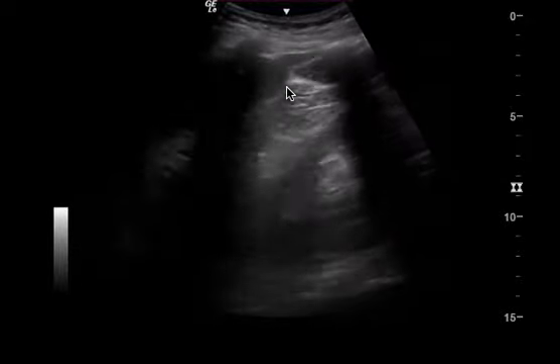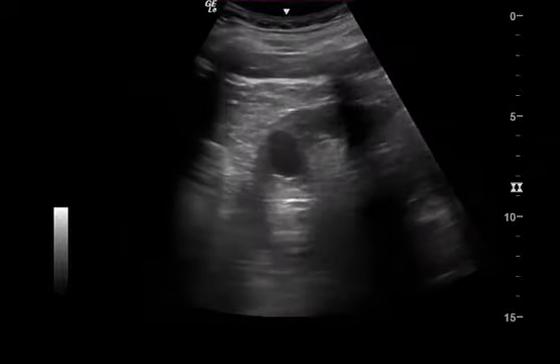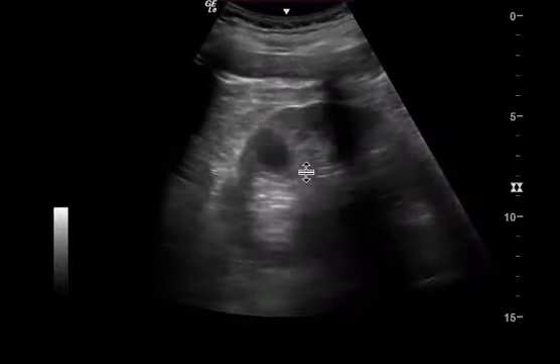So even though I don't really see any free fluid in this one spot, I still think it's a limited study. There is also this view here, and this focuses on the kidney, and you appropriately move the probe more towards the axilla.